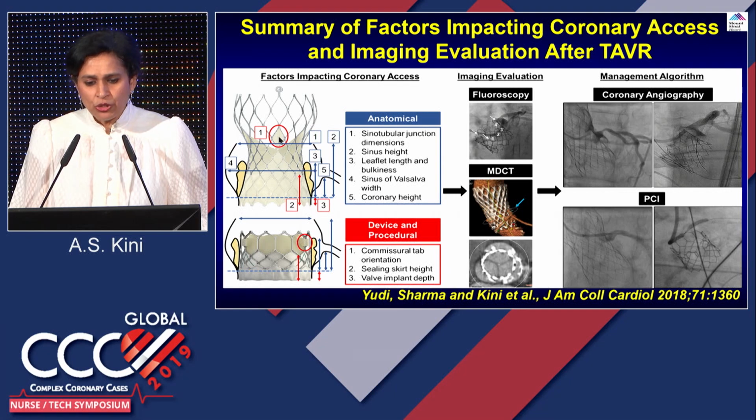So this is called a commissural tab. You see the commissural tab goes all the way high, and if this is very close to the left main, when the patient comes back, how are you going to engage? You have to make sure you're engaging from this particular diamond or this particular diamond, which would be very difficult.